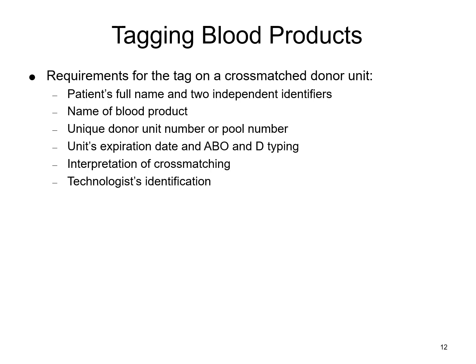On that unit, there is usually some sort of tag that's placed on it. That's going to include the patient's full name with those two unique identifiers, so date of birth, medical record number, usually that unique number that's on the donor unit or blood bank bracelet is going to be included as well.